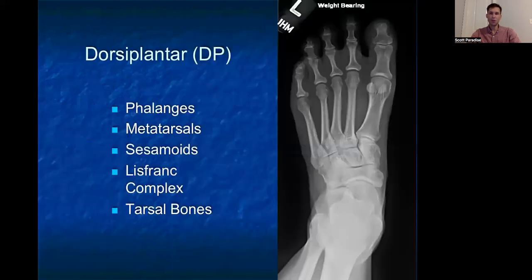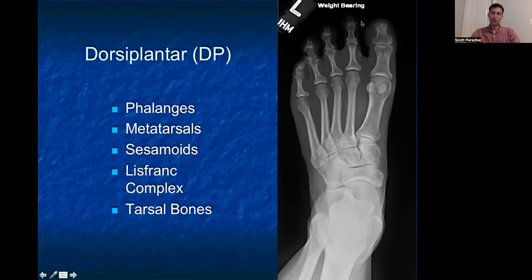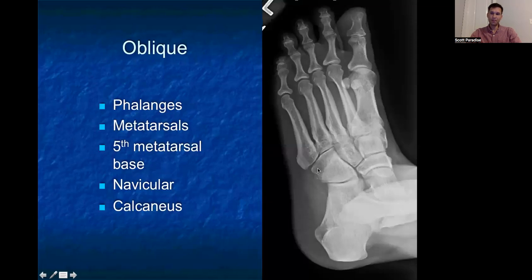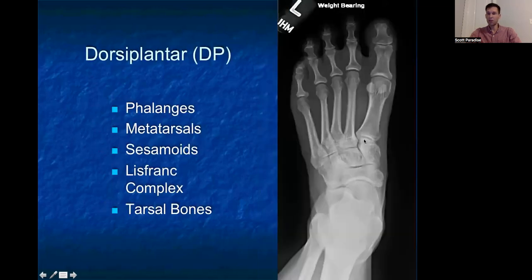Starting with our dorsiplantar view, we're always going to move from distal to proximal or proximal to distal — as long as we do it in a repetitive, systematic way. I always start distal and move proximal. I start with the phalanges, look at each bone, look at the cortices, look at the joint spaces, and move proximally looking at each one. Then I make my way to the metatarsals, look at the sesamoids, and finally the tarsal bones in this DP view. I also take a look at the Lisfranc complex here — don't want to miss that. We'll talk about that later in the talk.